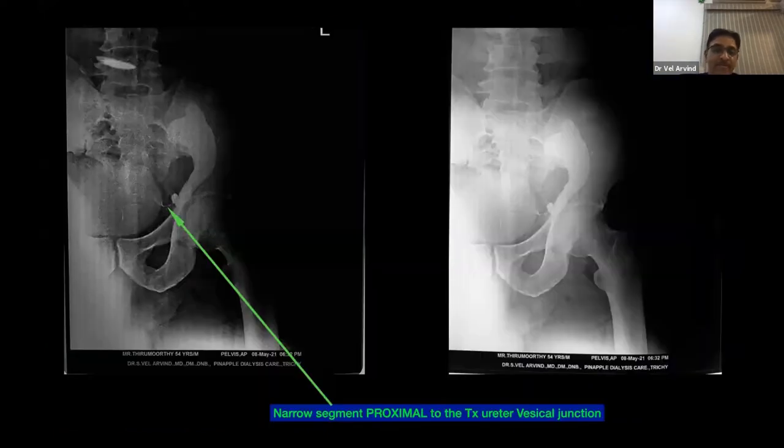So this is another patient. This is another patient near the urovesical junction. It got obstructed, so a thin rim is also created. It's another case. Four different cases: how they presented, how they were diagnosed, how they were managed. I mean, how one patient took me to another way. All these things we'll discuss on June 6th. And my mistake, I think nobody should repeat it in practice.